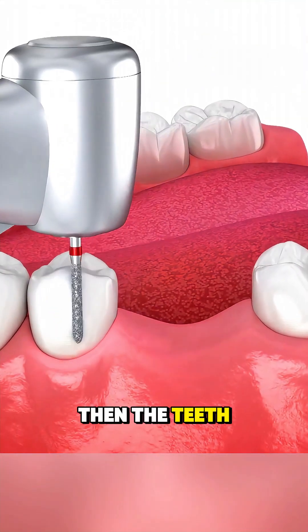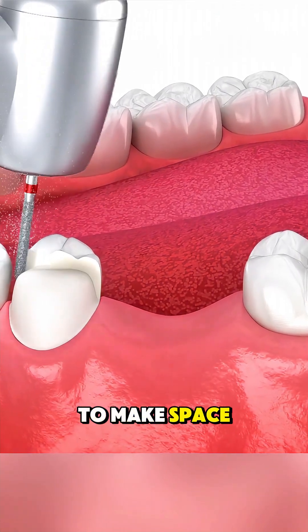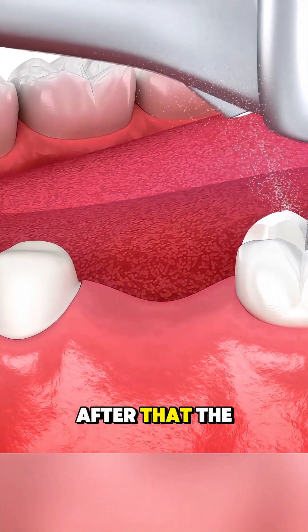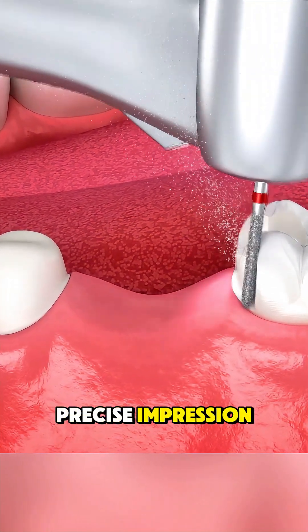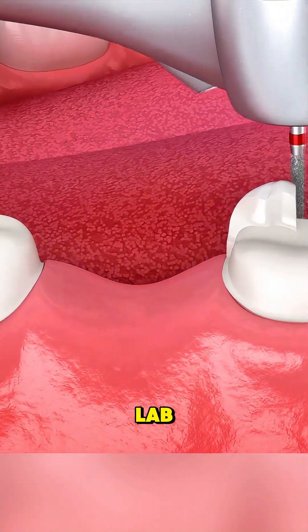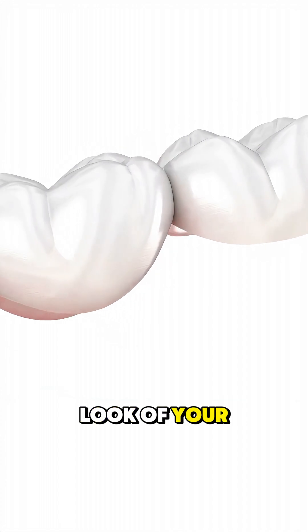Then the teeth next to the gap, called abutment teeth, are gently shaped to make space for the crowns that will hold the bridge in place. After that, the dentist takes a precise impression or digital scan of your mouth, which is sent to a dental lab where the custom bridge is created to match your bite and the natural look of your teeth.